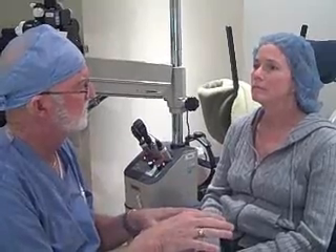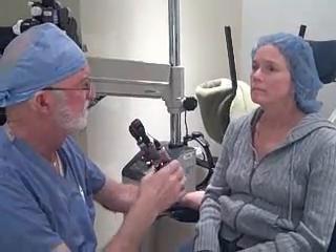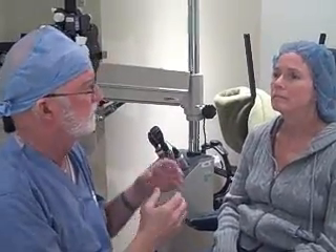So we've made the flap, and we're going to wait a few minutes for the bubbles to clear. Then we go into the other laser room that's going to reshape your eye and get rid of the nearsightedness — this is going to be the reading eye. What you've just had is the hard part. That's the good news — the rest of it's easy. You'll be lying flat under the laser. This laser has a green light for you to fixate on. You'll be looking at a green flashing light. When I go to lift the flap up, you'll feel a little pressure on your eye, but nothing like you felt in there. We'll have a little retainer in so you can't blink, and then the laser will kick in. When the laser starts, you'll hear a little noise and get a little ozone odor, sort of like burnt hair — that's the tissue being vaporized. So you just keep looking at the green flashing light. Your treatment will be over in less than 30 seconds. We put the flap back, come back in here and check it, and you're done.